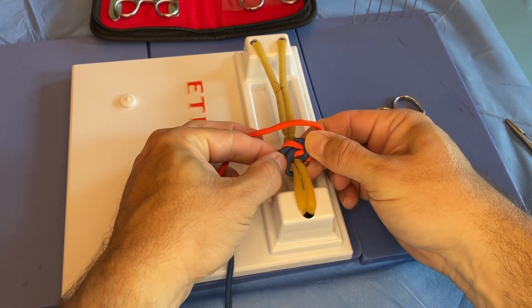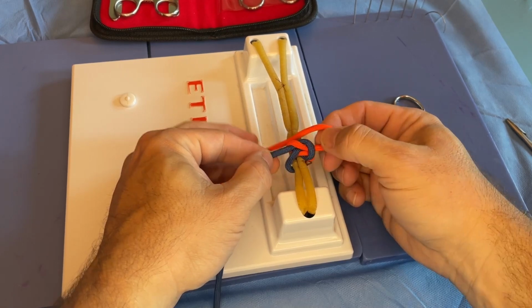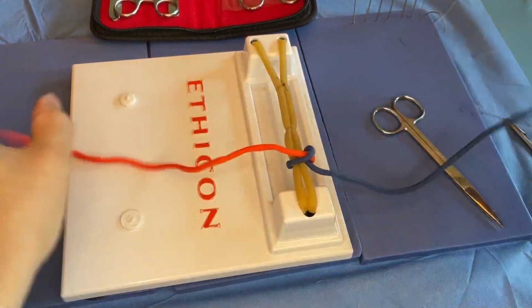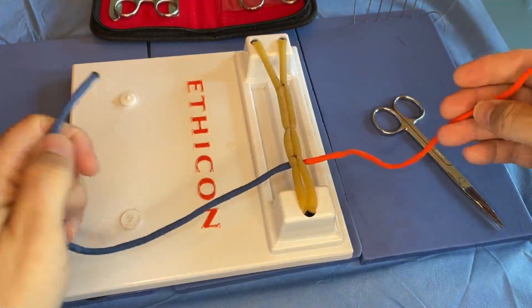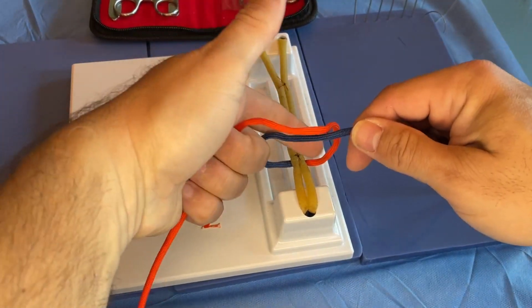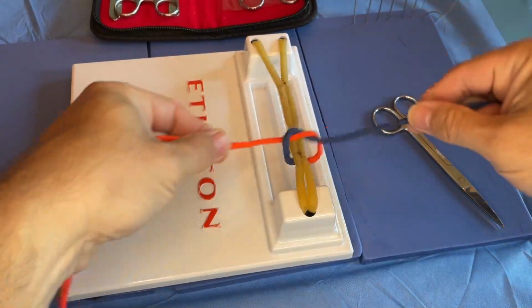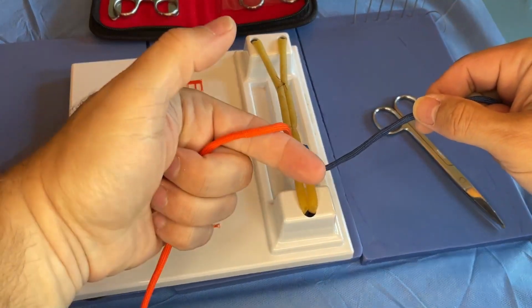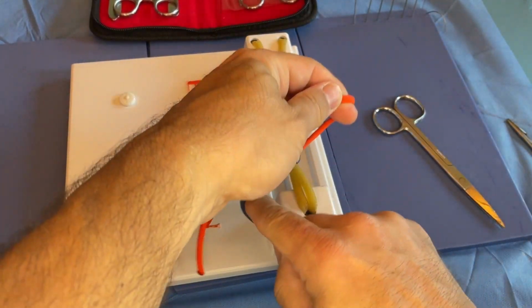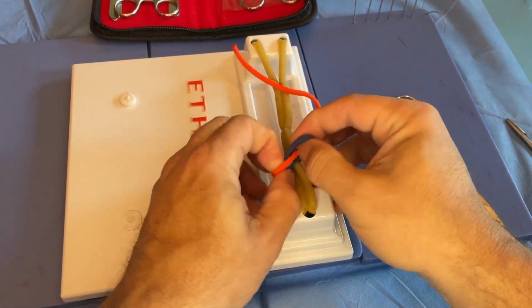So we've got the 2 blue strands coming through that orange loop, and the blue loop on the other side with the 2 orange strands going through it. So again, if you have a free tie, you'll always hear people say, cross the strands. So cross the strands, you've already got your loop started. Over the finger, pinch, swing through, bring the blue, go down. We did finger first, so then thumb, pinch through, and again, I do that little bit of pulling on opposite sides, and there's our square knot. So that's a 2-handed knot.